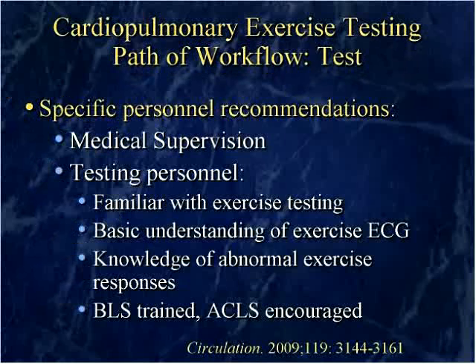As far as recommendations for specific personnel, medical supervision is typically warranted, although there are a lot of places that perform this test with trained allied health professionals, and the physician just available if needed.